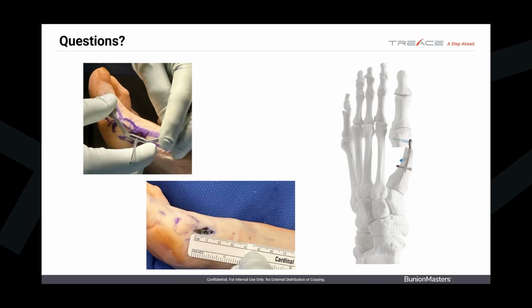How about implant removal if necessary? Do you anticipate that that would be a challenge? No, I don't think it's a challenge. What makes it a challenge is if you bury the bicortical screw. So you want to place that bicortical screw so it's sitting just at the level of the cortex. Don't bury it. Otherwise, when you do your medial spike resection, you're really opening up the internal contents of that plate for you to get all those screws out with that 1.5 centimeter incision.